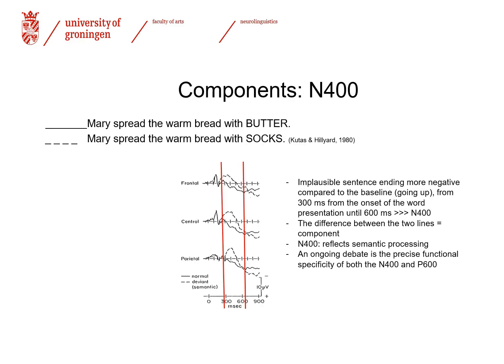The example that I am giving you here is from the seminal paper by Kutas and Hillyard from 1980. This is the first language-related EEG or ERP experiment ever carried out. The goal of the experiment was to look into how our brain reacts to unexpected stimuli in general, something that had already been done before in general neuroscience.